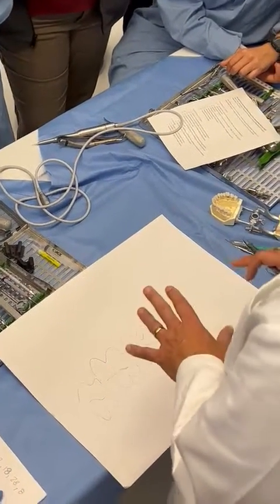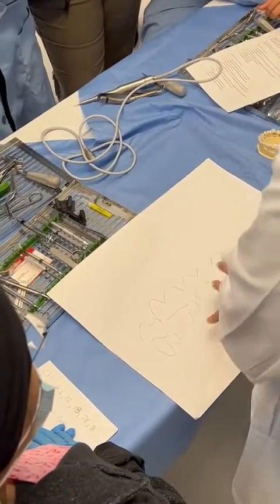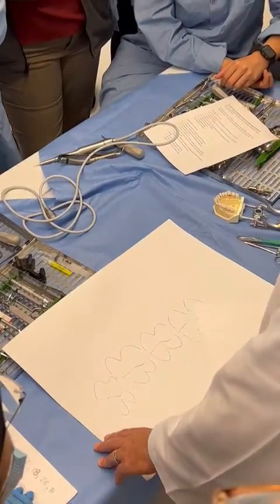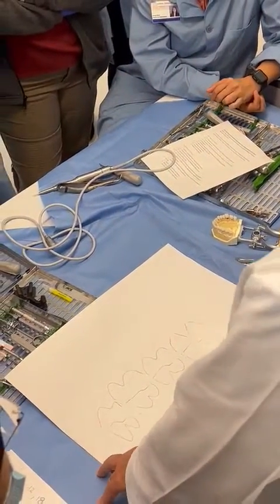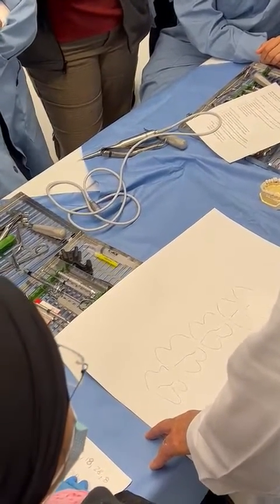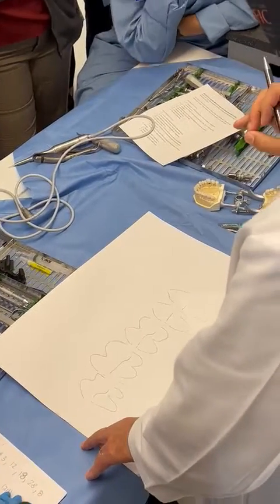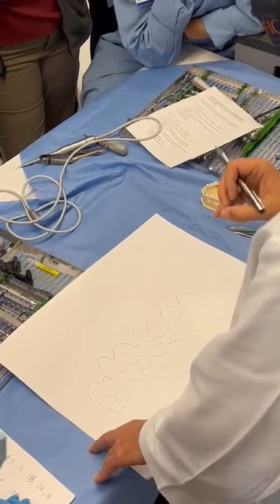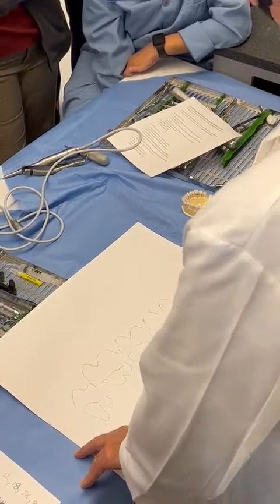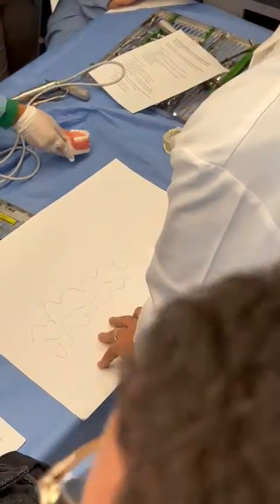So the general rule on full thickness mucoperiosteal flap is 2 papillae forward and 1 behind. Listen to me say this, okay? In dentoalveolar surgery, we do not use releasing incisions. It's a periodontal surgery approach. There are times to use releasing incisions. Come and get me, I'll show you. But I have students that took the perioral block, the first thing they do is drop a release. Don't do it. We're using envelope flaps here for dentoalveolar surgery.